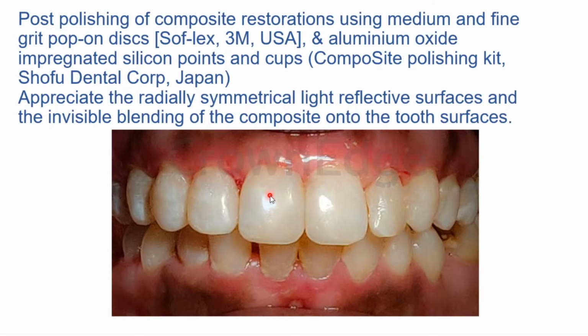Before that, let me just tell the future treatment plan. In this case, we also planned for a post and a crown. In this case, we were using minimally invasive pin posts from Dentapreg, followed by a crown because this was endodontically treated. This was a temporary approach. Also, I wanted to correct a little bit of that rotation of the teeth, which you can see over here. It's slightly rotated. So I corrected that as well with the crown. So that has not been documented in this. This is just limiting to anterior aesthetic rehabilitation.